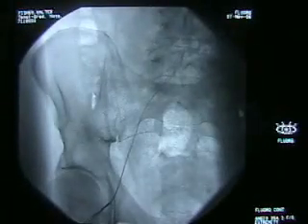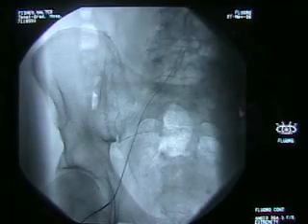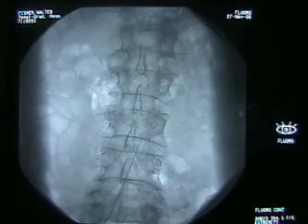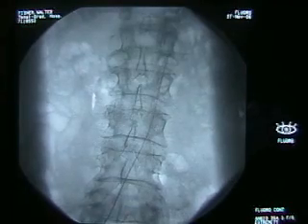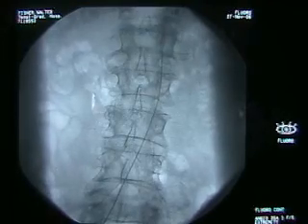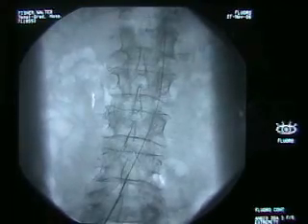Here we see the catheter being inserted in the femoral artery. The guide wire is positioned into the abdominal aorta, the large blood vessel within the abdominal cavity. Our target vessel is the renal artery, and the guide wire is positioned at this level. A catheter is advanced over the guide wire up to the level of the ribcage.